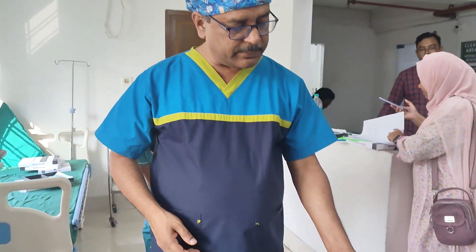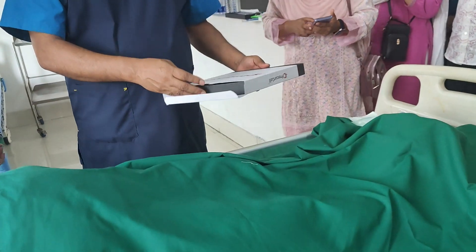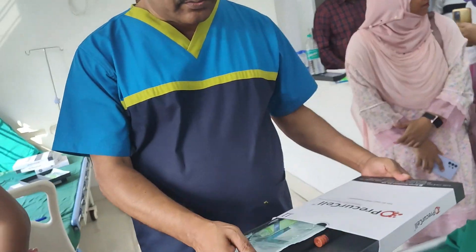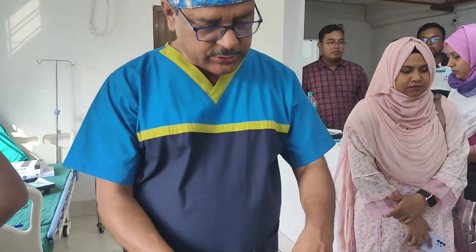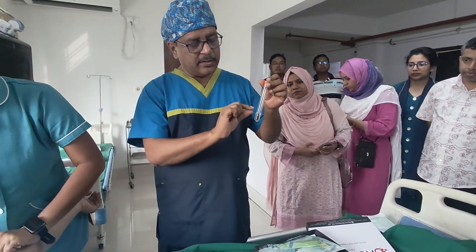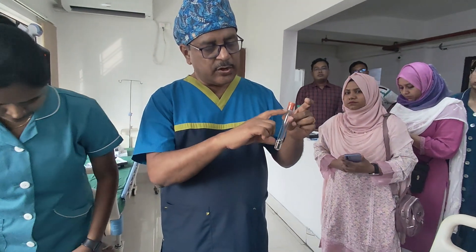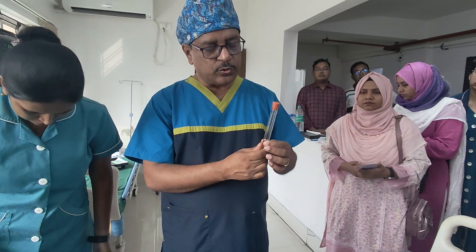This is a PRP kit. There are several types of PRP kit, and this is one of them. Here we have one test tube which has a gel and an anticoagulant. Normally this anticoagulant is acid citrate dextrose, and this is a kind of vacuum tube with which we draw the blood.